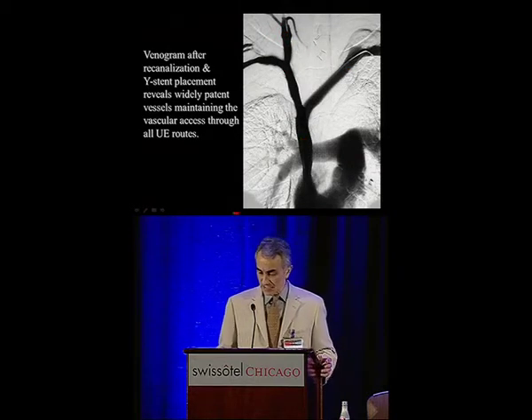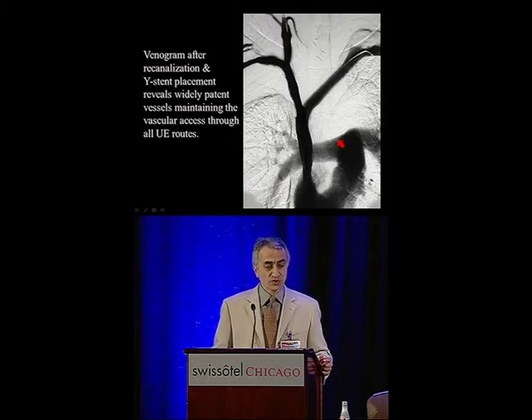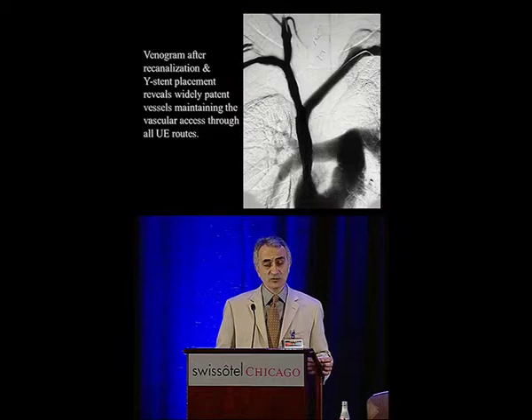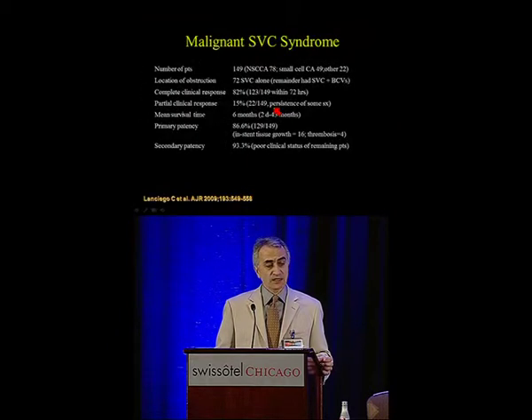So this was well and good, and we treated a number of patients with these, except in the long-term follow-up, we discovered that at the points of fenestration, we have a high rate of restenosis in these patients. So we've gone away from that, and the way I treat them now is by sort of a short double-barrel stenting using nitinol stents. And in the next talk, I'll briefly describe why that is.